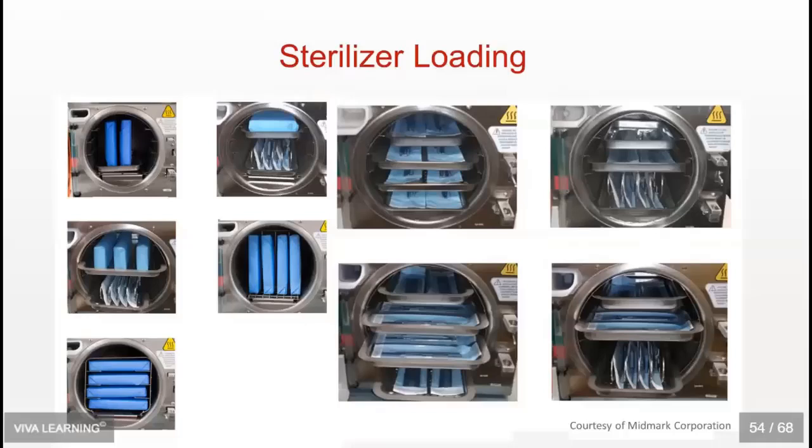And I'd like to thank the Midmark Corporation for these pictures because I think this illustrates beautifully some of the options that we have for placement of both pouches as well as packages inside of a sterilizer. And you'll see that using the racks allows for the spacing of the pouches so that in fact both the steam and the drying cycle can adequately access all the instruments.